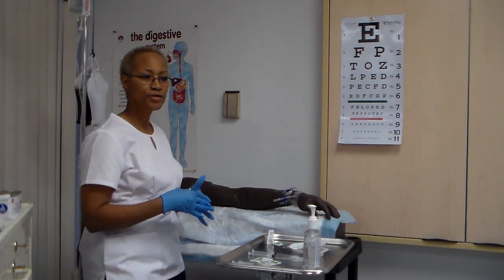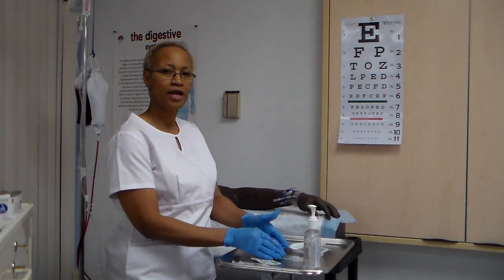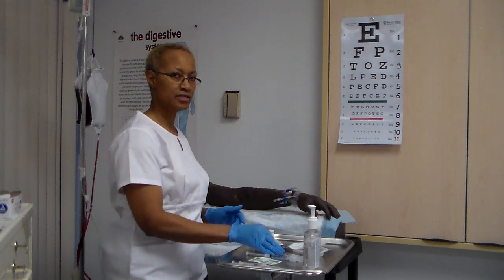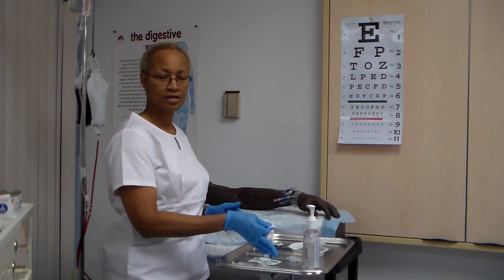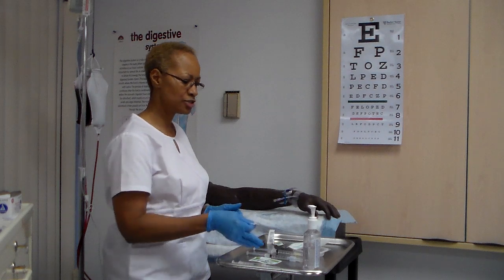Okay, so whether you're providing heparin or not, it is the hospital or the facility's policy. But with either, you're going to have 2 saline syringes. If the facility or the hospital requires heparin, then you would have saline, antibiotic, saline, and then your heparin. So that's your SASH method. S, A, antibiotic or your medication, S, then your heparin.